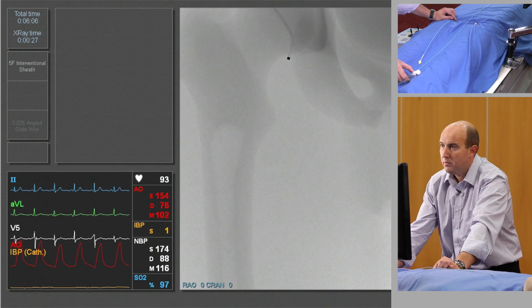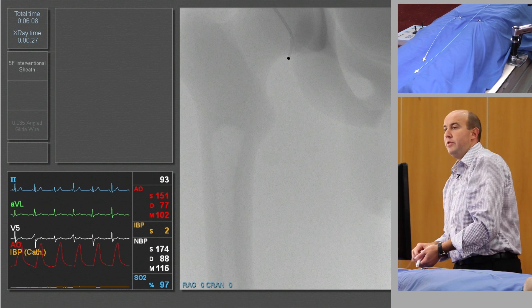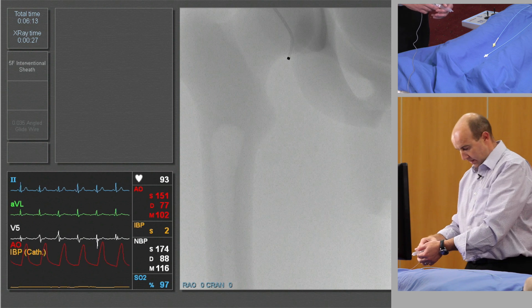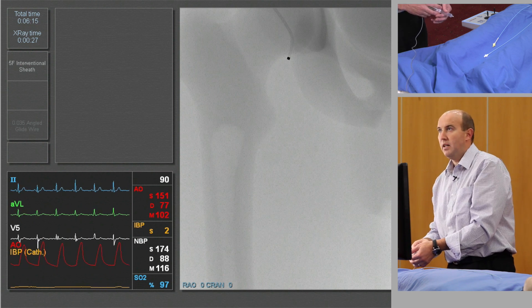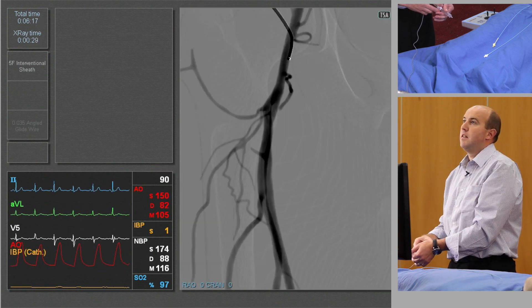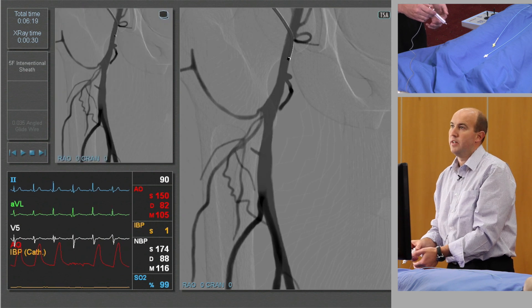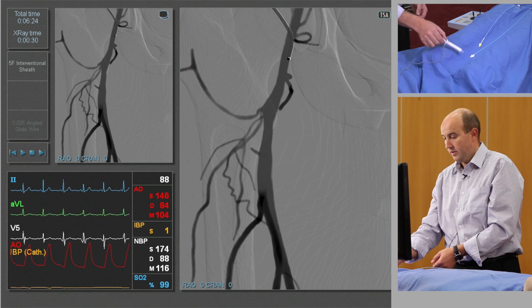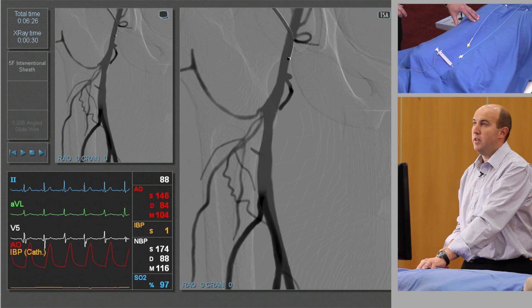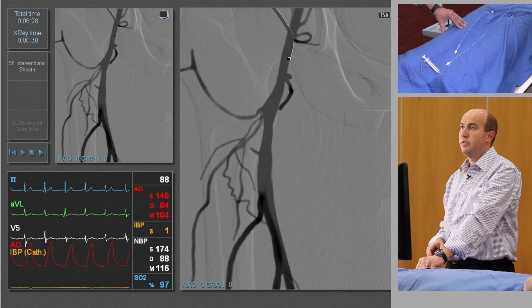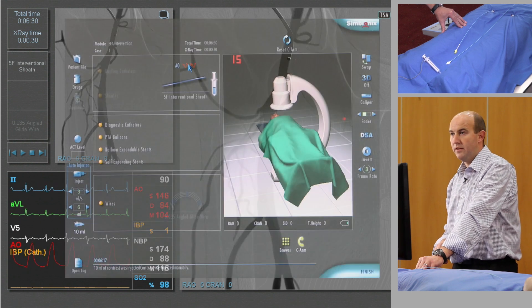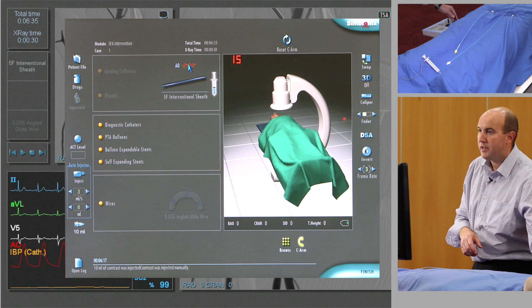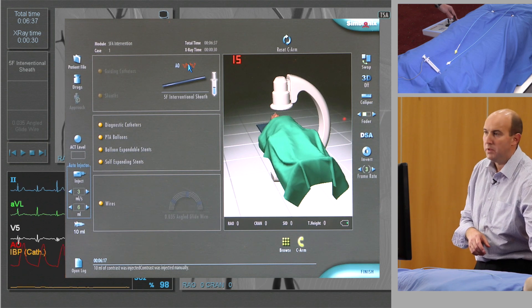At this stage we are in an AP position. I'm going to perform a diagnostic angiogram by selecting the DSA, which is the middle pedal, and injecting contrast. There doesn't seem to be much to see that's awry at this point, but it is a sheath run — a groin run — so we'll need to do an oblique so that we can see the femoral bifurcation. For this we need to put a little bit of ipsilateral oblique; it is the right groin so we would be going RAO.